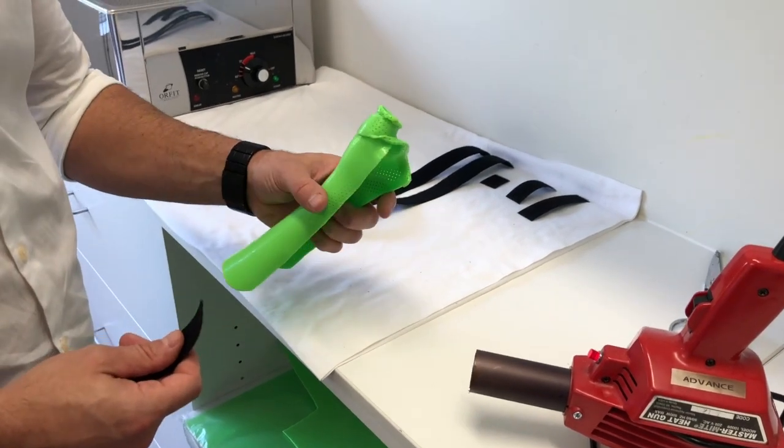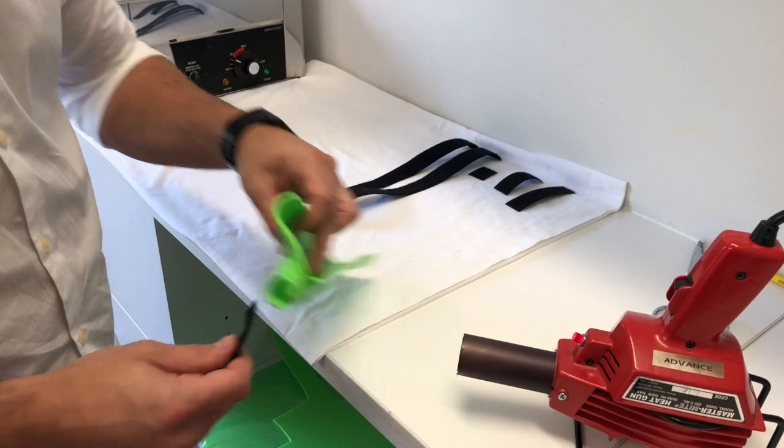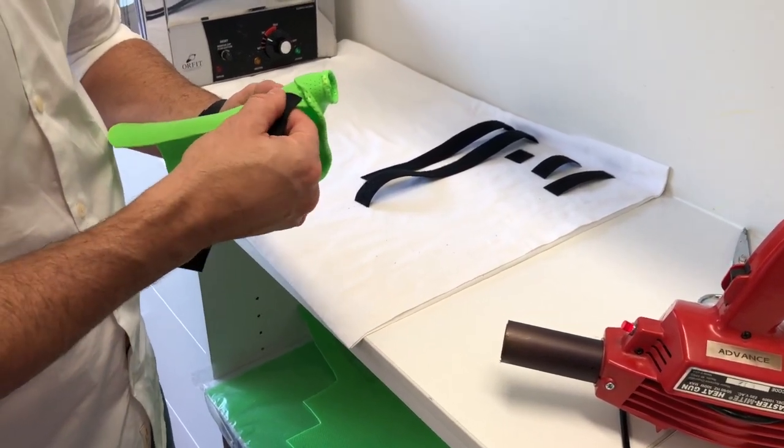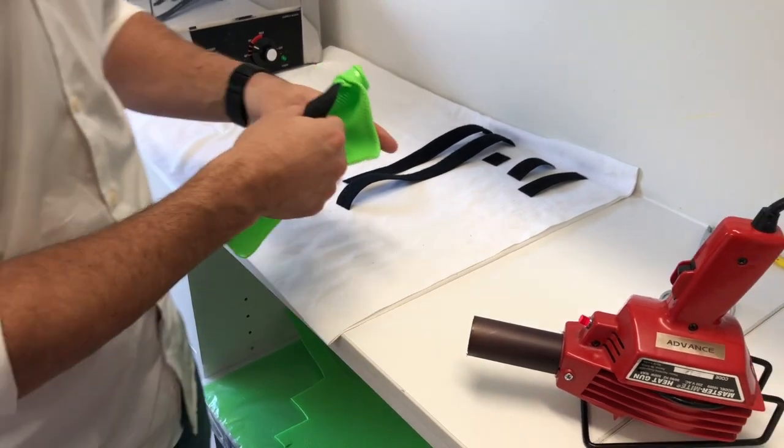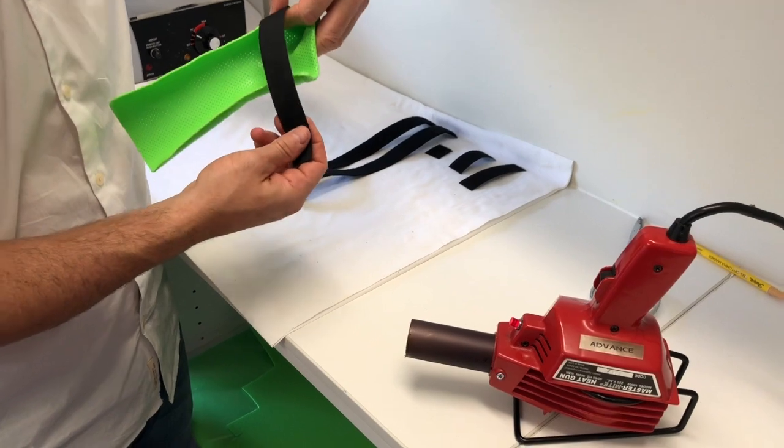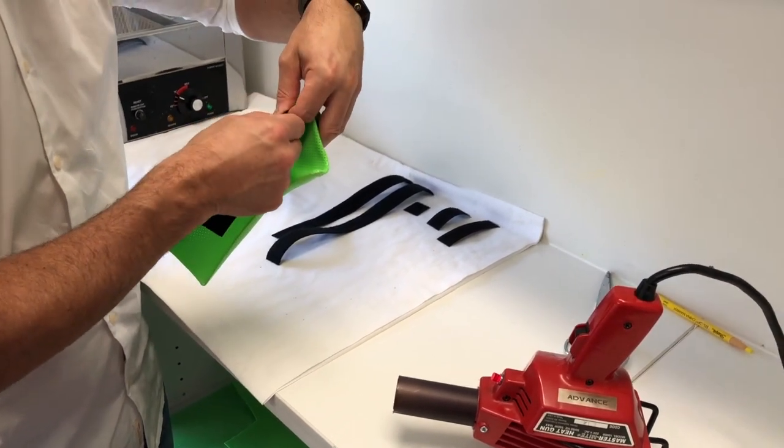So we're just finishing off by putting our straps on. I'm going to heat the thermoplastic, heat the velcro and bond the two together. Just be mindful, we're using Orficast Colors here. So it does have a non-stick coating on it, which means that our straps don't stick to it quite as well as they do with the Orficast Light.